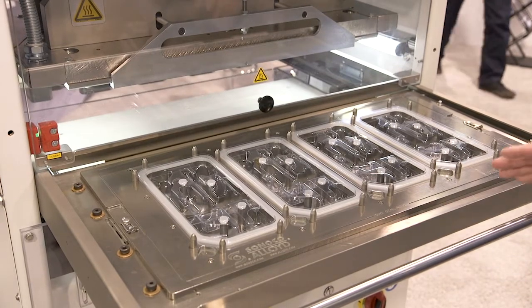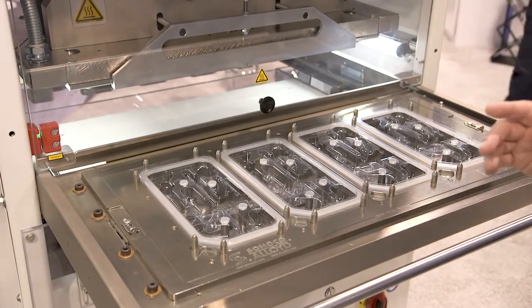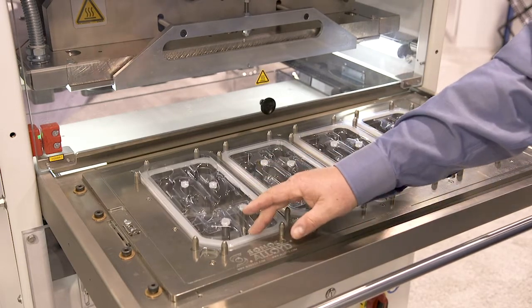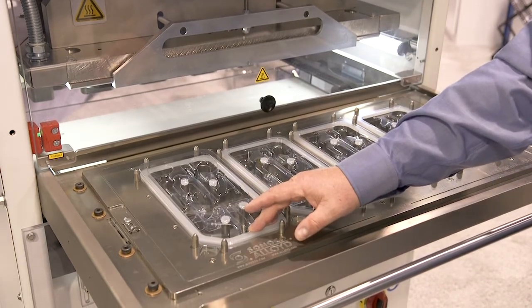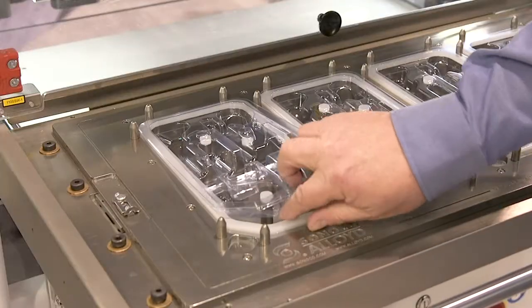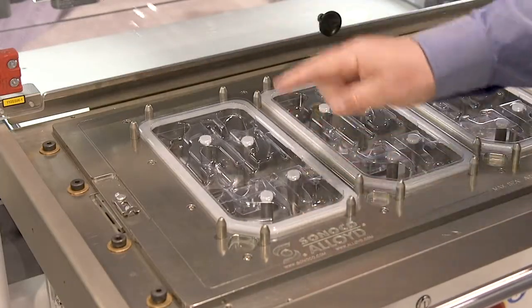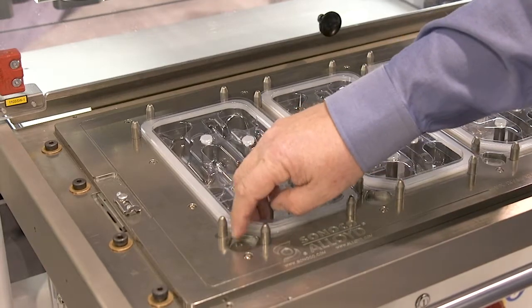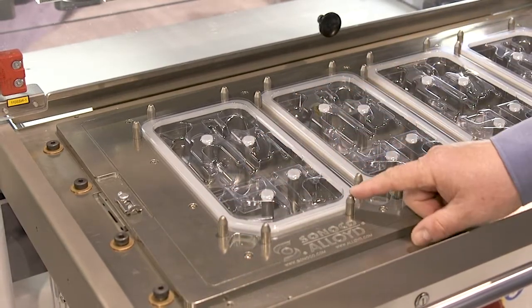Our premium grade medical tooling comes with an FDA approved coating, tea gaskets that can be placed simply by just pulling up and removing, island seals, easy removal tabs, as well as our custom made spring pins.